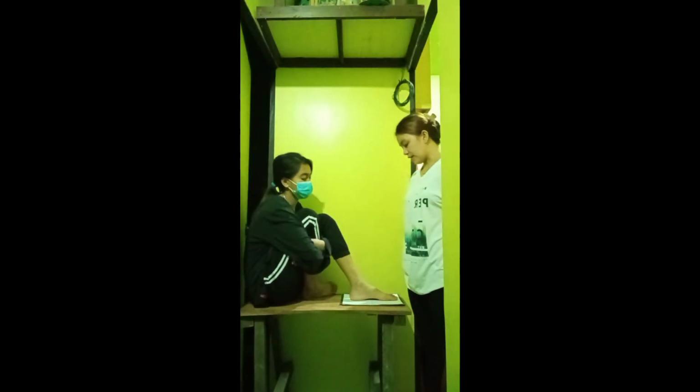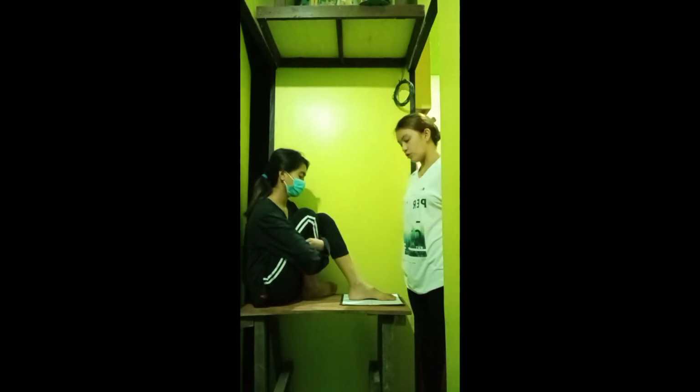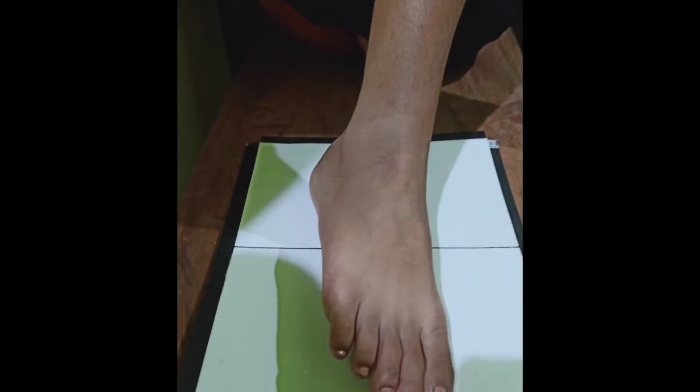To reduce the distortion of our patient's foot, this is where the AP axial projection of the foot of our patient comes in. The central ray is directed entering the metatarsal, angled 10 degrees posteriorly. This projection demonstrates the interphalangeal joint spaces and the metatarsophalangeal joint spaces.